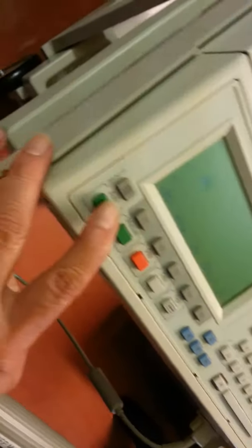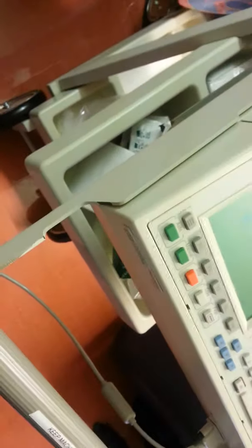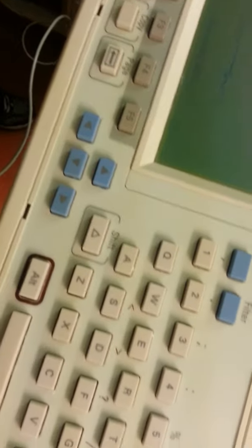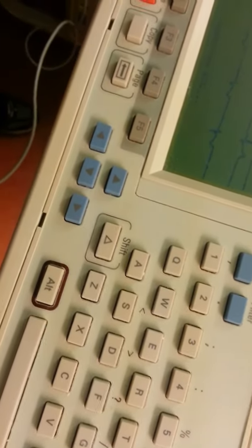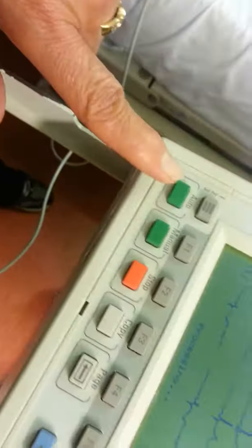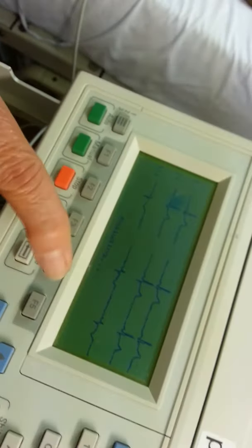Something is missing here — I think this one. If there's no tracing, make sure all the lines and connections are okay. The screen shows no ID, and it says 'acquiring EKG,' so you press the power and then select auto.